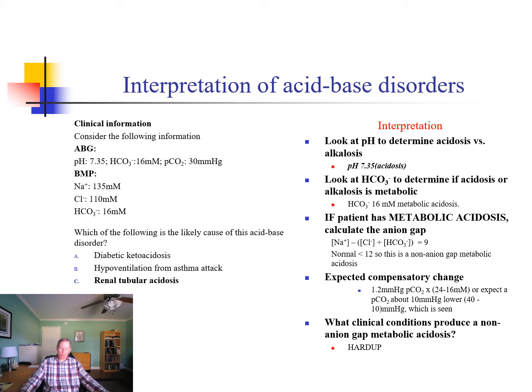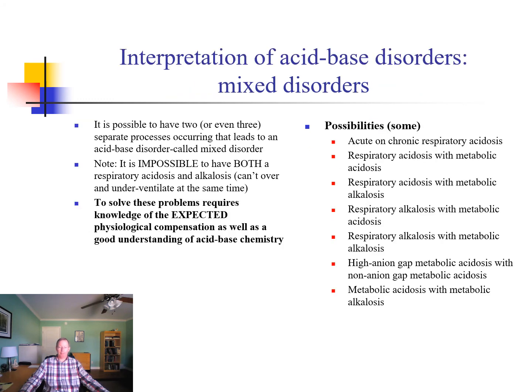So it's very useful to try to figure out what's going on clinically when you have these types of data, but you have to know how to interpret them. That was the simple thing. Life is more complicated. So life can also throw you mixed disorders.